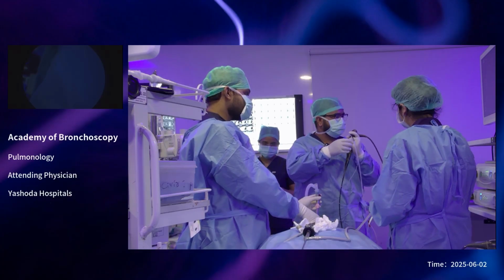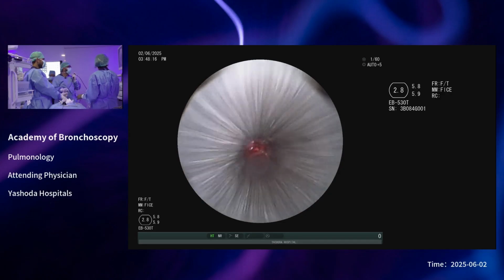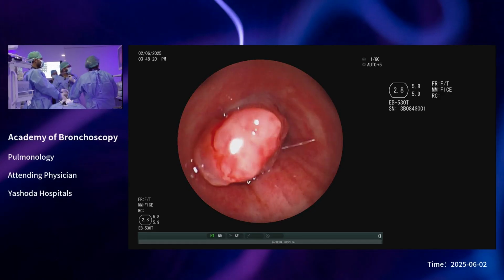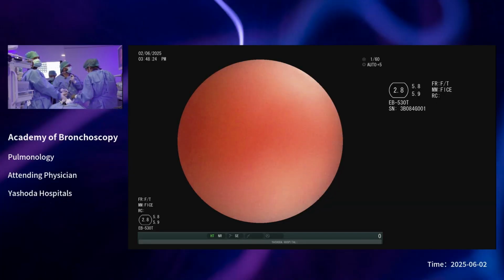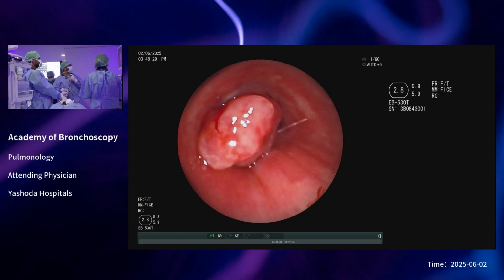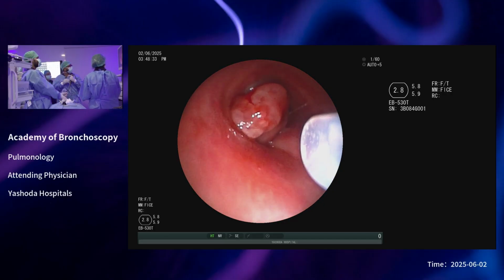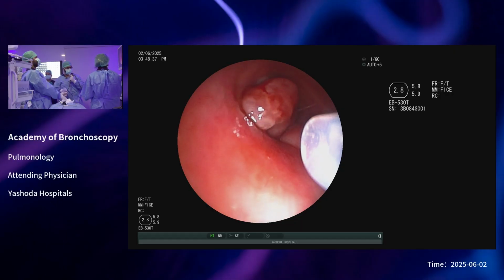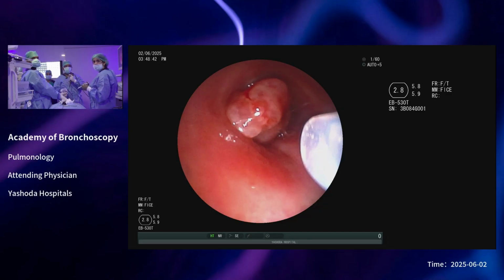Okay, pull back. So we can pull the barrel a little back so that it doesn't come in the way of the flexion of the flexible bronchoscope. Get the sheath outside. Okay. Loop it from below upwards as the attachment of the tumor is onto the anterior wall.